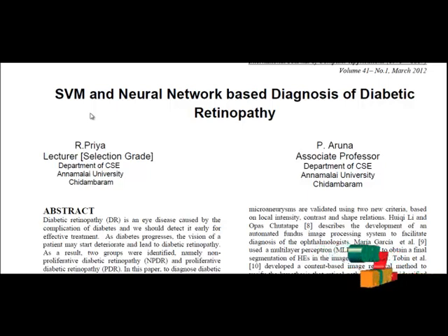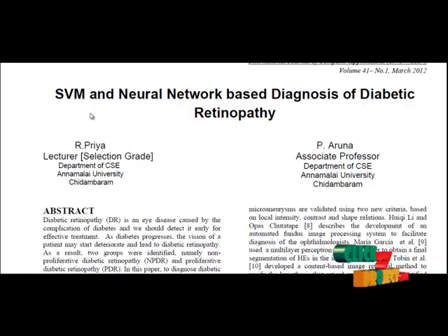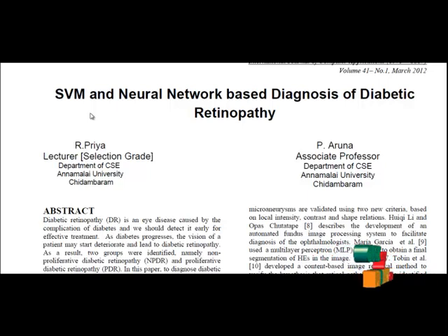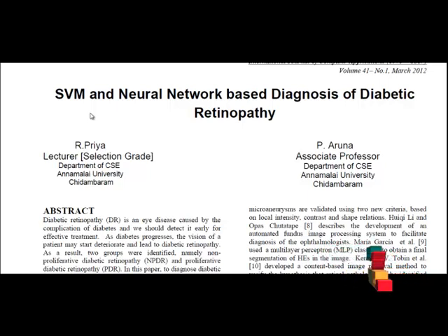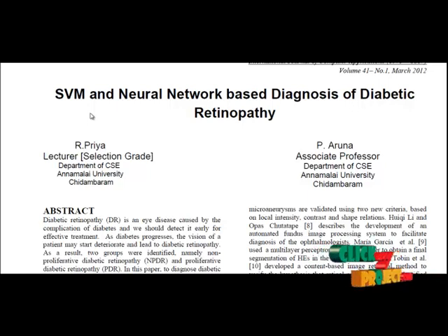The evaluation of the proposed automated diagnosis system of diabetic retinopathy has been performed using a set of images, which is a combination of normal NPDR and PDR-affected images. The original image is converted to grayscale image. After that, adaptive histogram equalization is applied to improve the contrast of the images. Then, resizing is applied and a median filter response is applied to reduce the noise in the images.